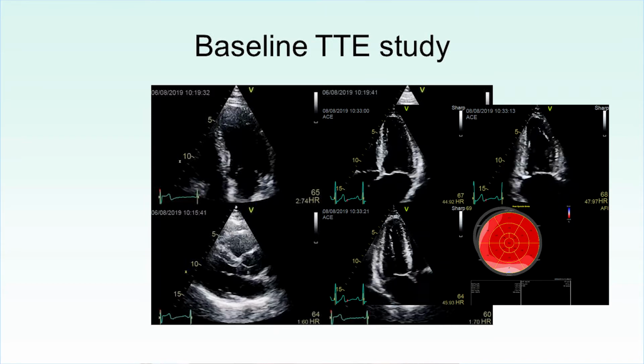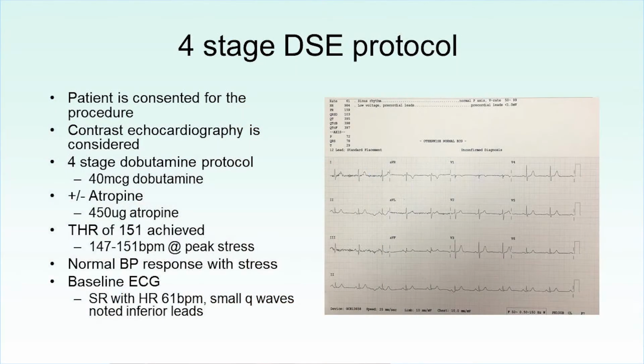therefore we thought we'll use contrast because it is important that if you see segments not seen, certainly if you look very carefully, not seen there, the posterior is not seen again, and also the apex and the anterior region is dropping out there. So it's important to use contrast. So we go on to use contrast for these patients.